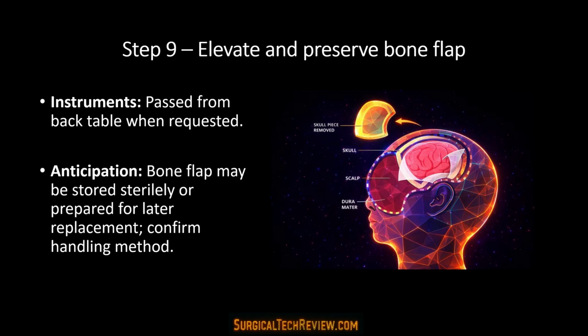Step 9. Elevate and preserve the bone flap. The bone flap is carefully elevated and preserved in a sterile manner for later replacement. In cases of severe swelling, the bone may be left off.